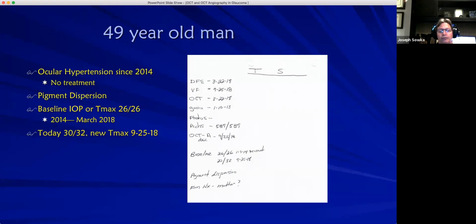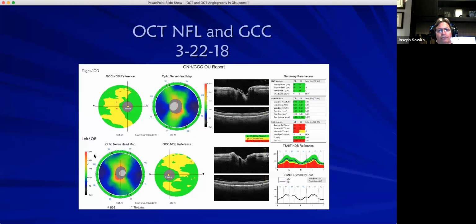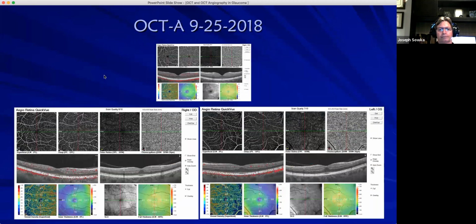It is another tool in the armamentarium, much like OCT. I think that if one were to employ this in their diagnostic armamentarium, it would help elevate their practice to an elite level, much like OCT and OCT-A. At some point, we could get overwhelmed by the amount of information. That's why I still think that perimetry and disc analysis are very, very important.